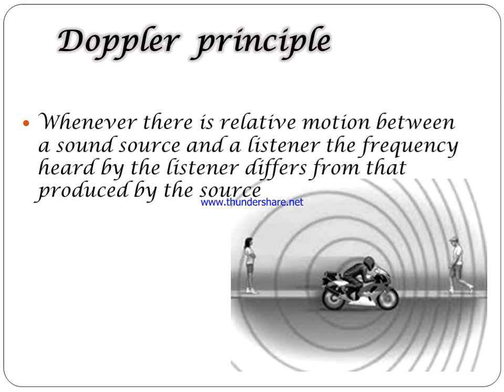Now we see the Doppler principle. The Doppler principle means whenever there is a relative motion between the source of sound and the listener, the frequency heard by the listener differs from that produced by the source.